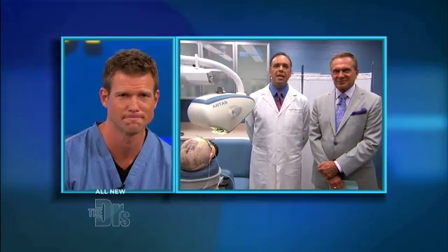Here to help us explain this procedure is Dr. James Harris, a hair restoration surgeon in our procedure room with Dr. Ordon. Thanks for being here. Thank you for having me. So talk to us about the ARTAS machine.